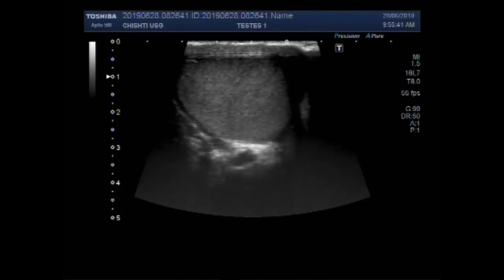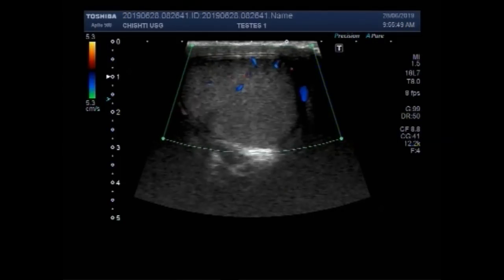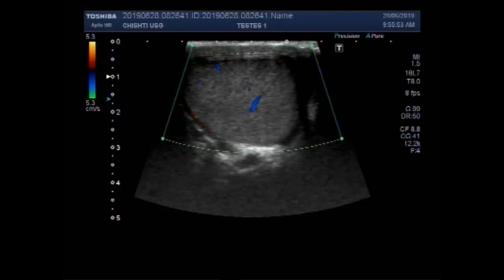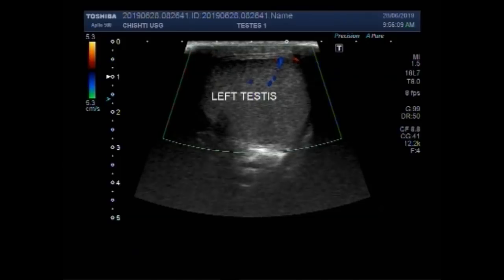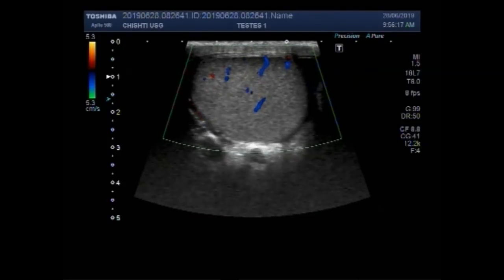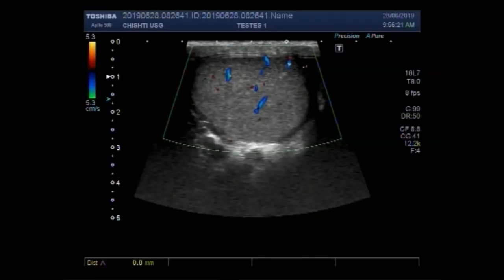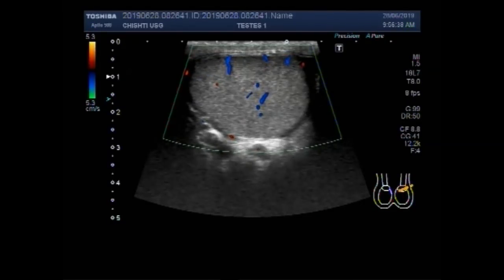Now you can see the left testes. It is of normal size, shape, and ecotexture. Blood flow is also seen. So this is an echo-normal left testes. No pathology is visible in the left testes. It measures about 3.5 cm by 3.3 cm. Blood flow is also normal, and echo-density is also homogeneous.